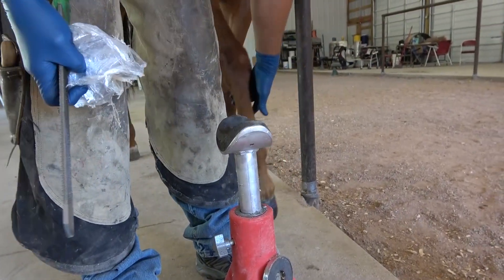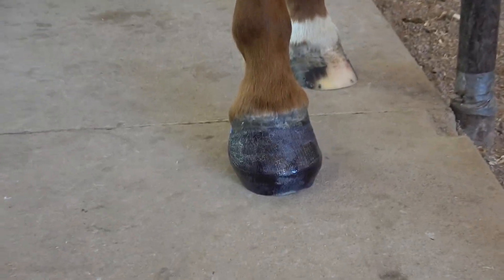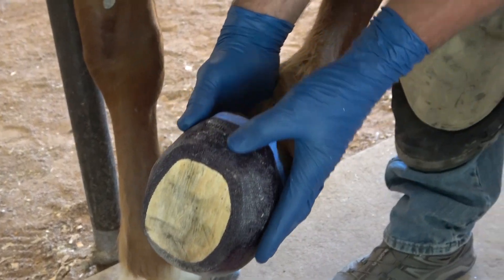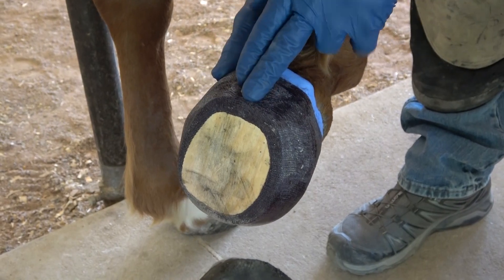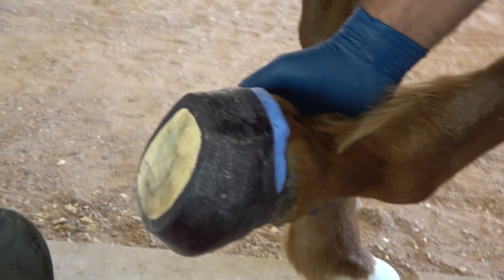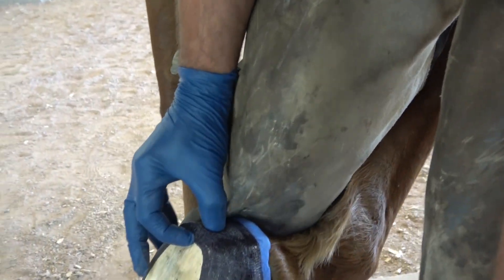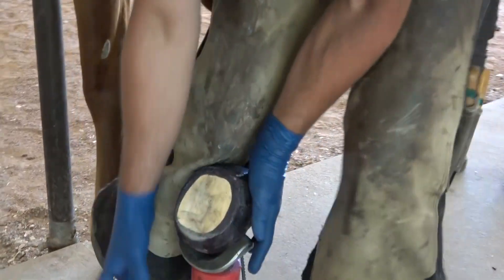One of the tools we all have as a farrier is a rasp, and I find this works really well for moving stretch wrap — I just file right through it. One of the things after we're done casting is that sometimes the material gets built up at the heel position, so I just want to soften this heel on the landing. What can often happen if we don't file this down is it'll wear the toe and this will not wear, creating an excessive wedge.